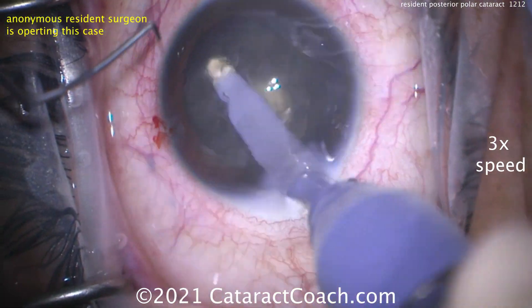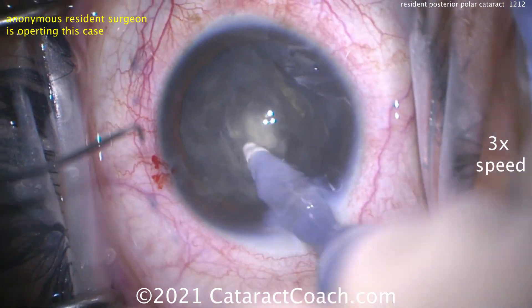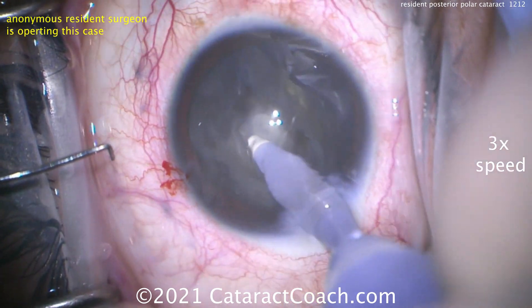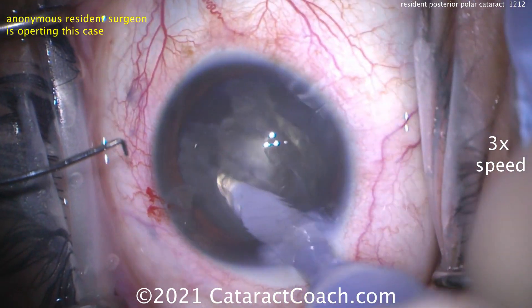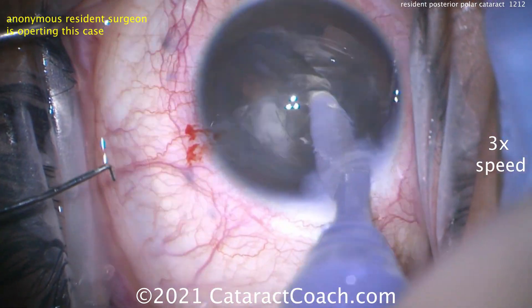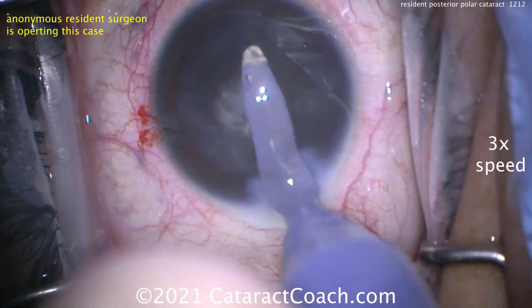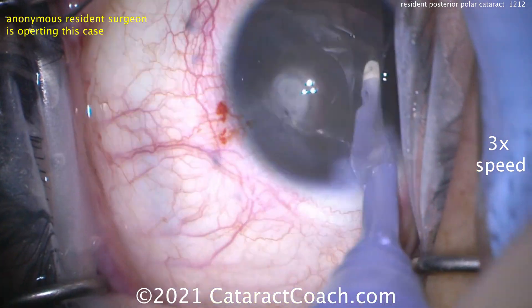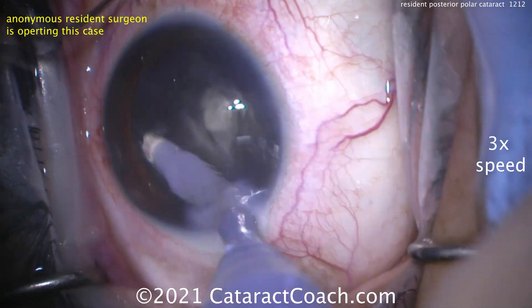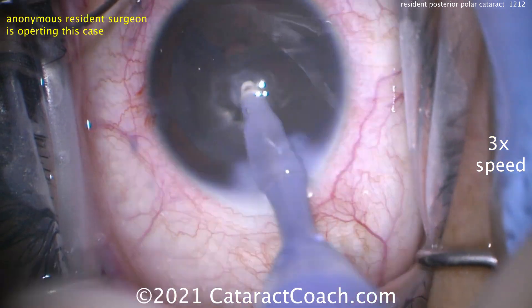The key in this — and this is where the resident has some trouble — is you need to keep the tip of the IA probe occluded with lens material. Get that bevel turned around, feel free to move it around, and aspirate all this out. You don't need the phaco probe; if you use this proper technique it'll actually aspirate very quickly. The resident's getting a little stuck here, so we'll help out. We want to get this lens material up out of the capsular bag and stay away from that posterior capsule.